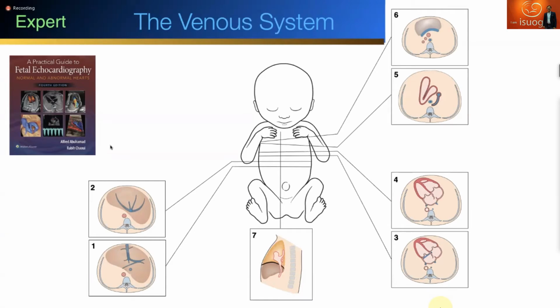And furthermore, the expert will understand also how to scan systematically the venous system from the upper abdomen toward the coronary sinus, the pulmonary veins, the azygous vein, and the brachycephalic vein.